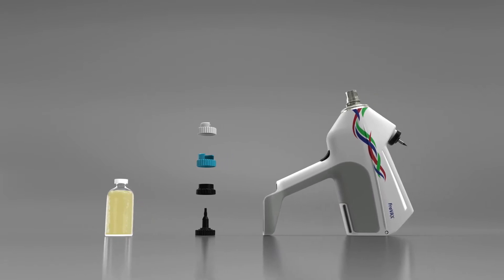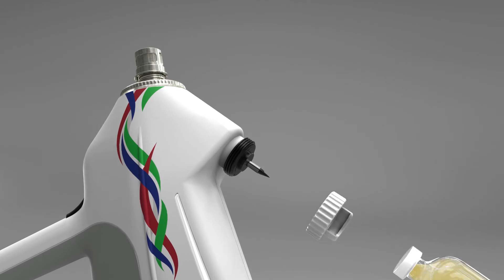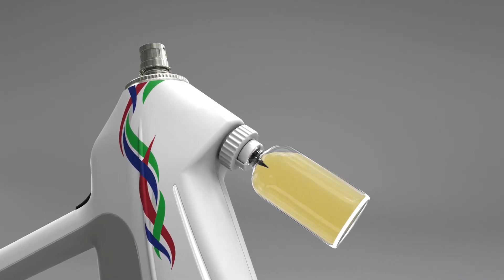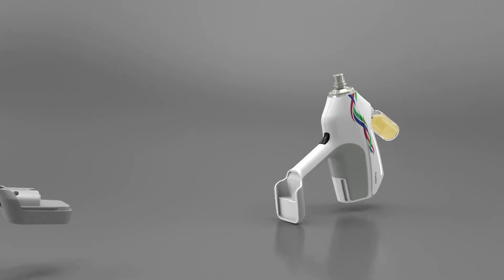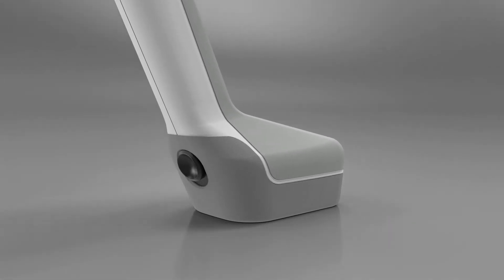Prior to inserting the battery, choose an appropriate bottle collar and connect your vaccine bottle to the bottle holder. Please do not use Freevax without a mounted vaccine bottle. By inserting the battery, Freevax will be automatically switched on.